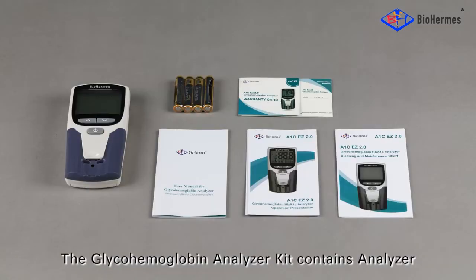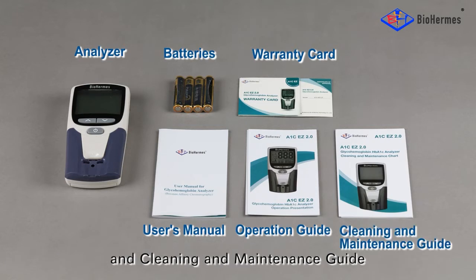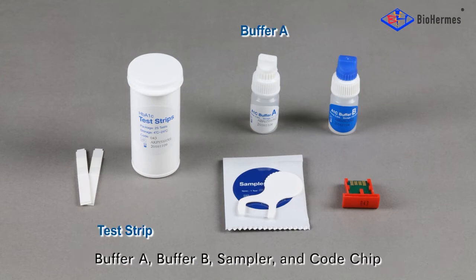The GlycoHemoglobin Analyzer Kit contains the analyzer, batteries, warranty card, user's manual, operation guide, and cleaning and maintenance guide. The GlycoHemoglobin Test Kit contains a test strip, buffer A, buffer B, a sampler, and a code chip.